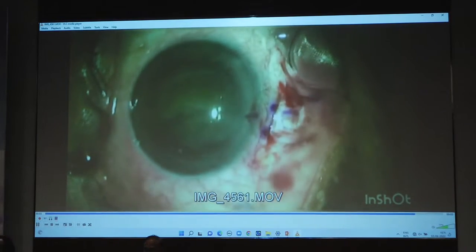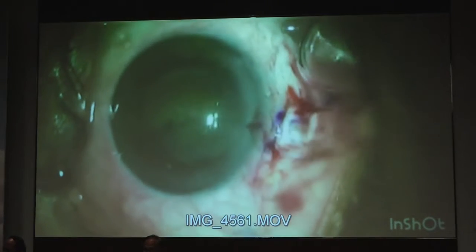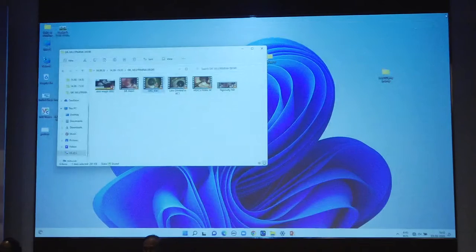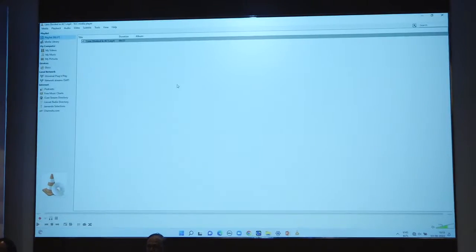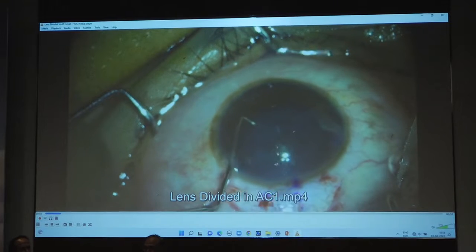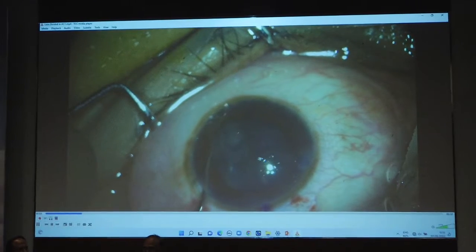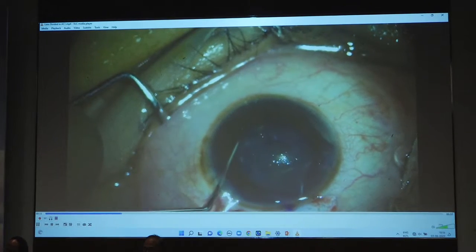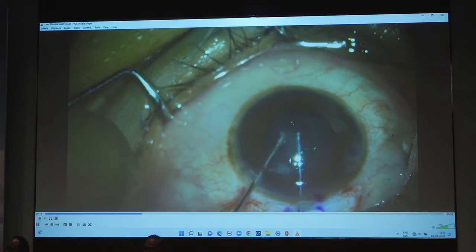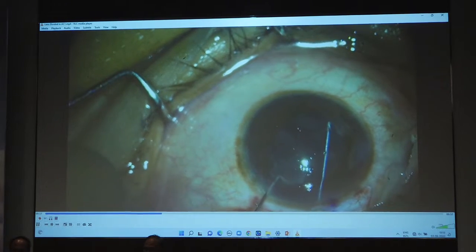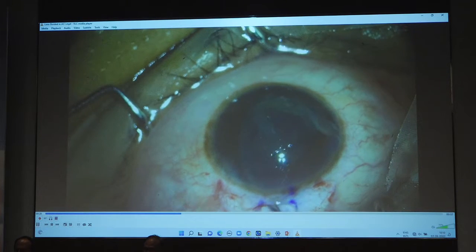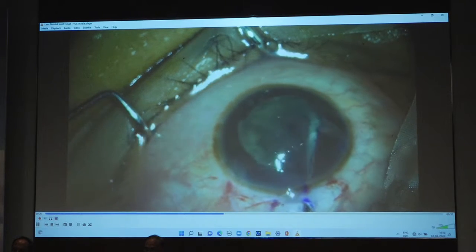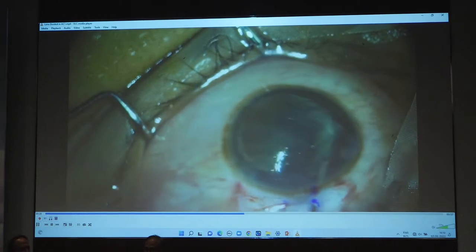Phaco fragmentation in the bag can also be done for nucleus removal. For soft nuclei, it is advisable to use a flat instrument such as an iris spatula to take the nucleus out of the bag — do not use a cystitome or Sinskey. The nucleus glides out easily. Dr. Sahu's video shows using Khan's chopper to divide the nucleus in the bag and take it out in halves.